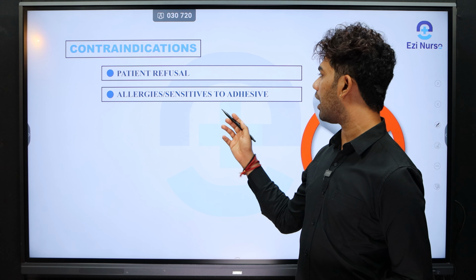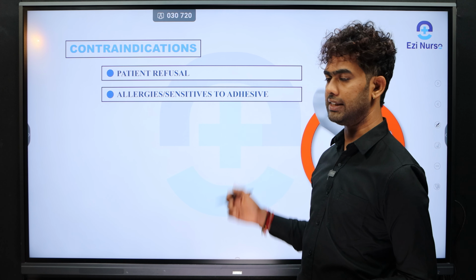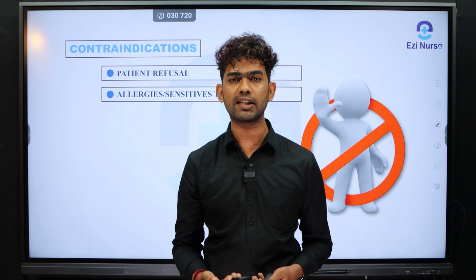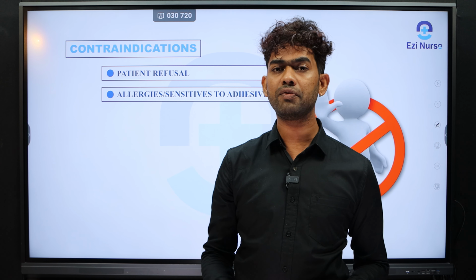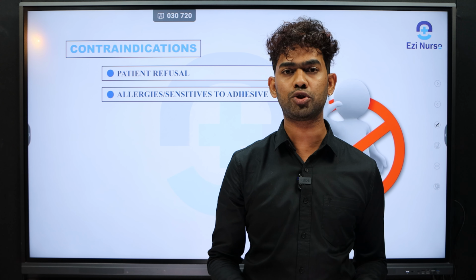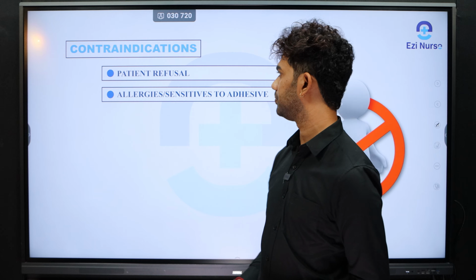The next will be allergies and sensitivity to adhesive. Some patients may be allergic to electrodes, especially latex allergy. Instead, we can place non-latex electrodes on the patient's body to avoid this situation.